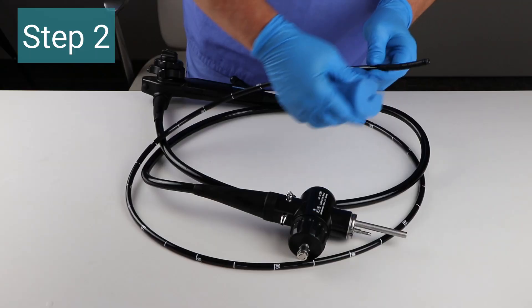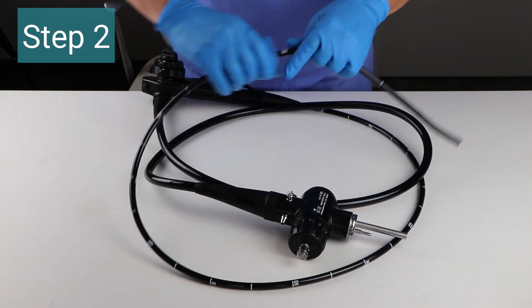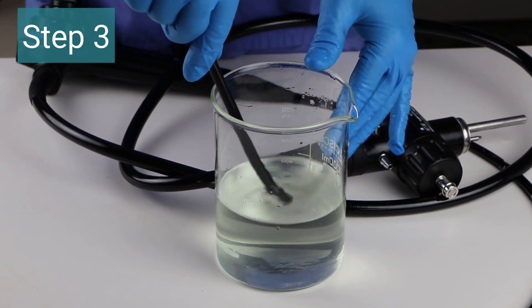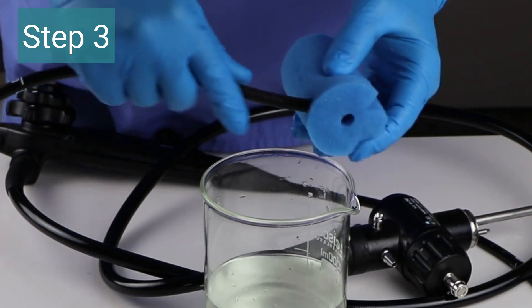Step two: lightly squeeze the sponge and wipe off the exterior surfaces of the endoscope. Step three: place the distal tip of the endoscope into the solution. Soak for one minute and then wipe with the sponge.